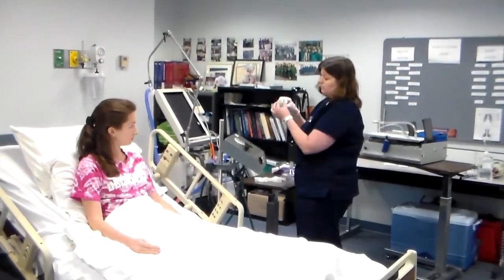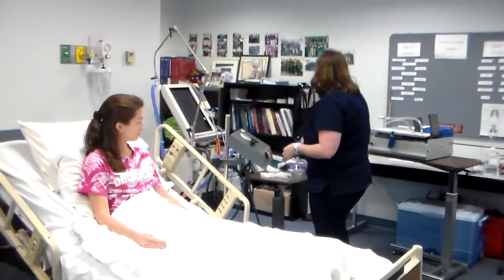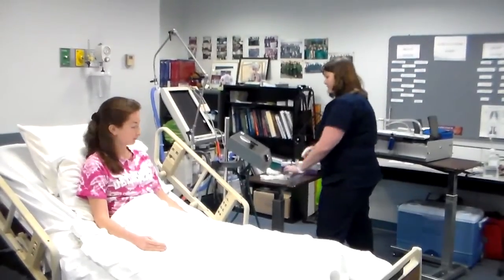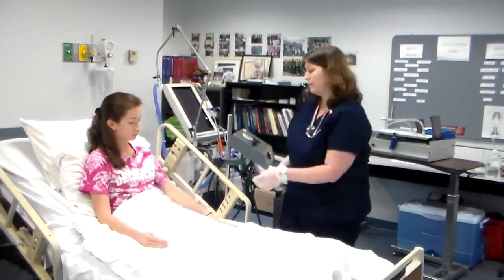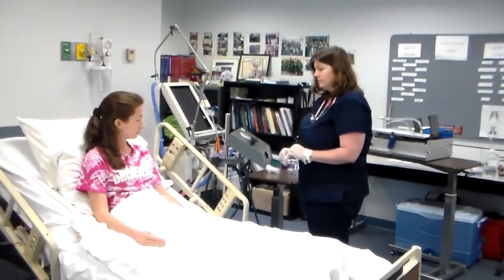Before beginning the treatment, be sure to check the patient's chart, verifying doctor's orders for the Metaneb. Wash your hands and put on gloves. Check the patient's armband to assure that you have the correct person. Then perform an assessment on the patient.